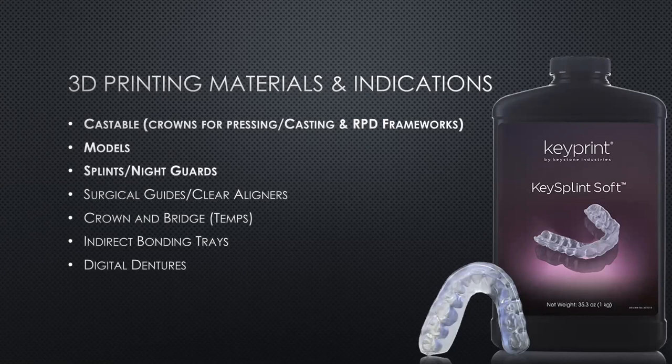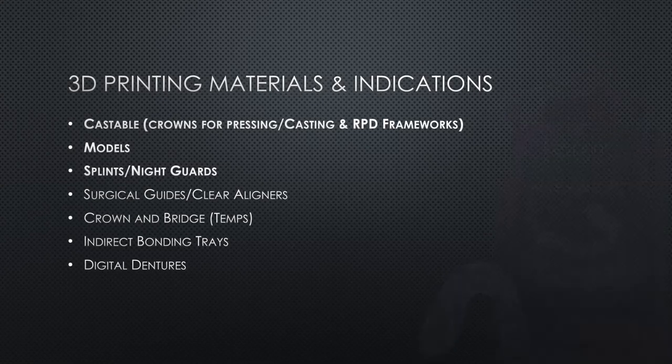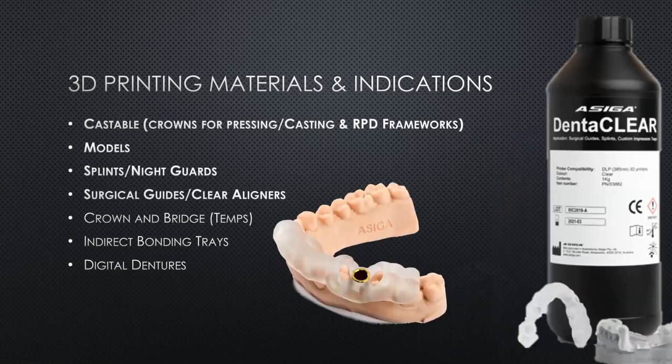Surgical guides are another popular use for 3D printing. Guided implant surgery makes things so simple and predictable for placing implants. So typically, if I'm doing an immediate load case, we will perform a virtual tooth extraction, design a temporary crown to fit over a temp cylinder, and produce the surgical guide with the corresponding sleeves.